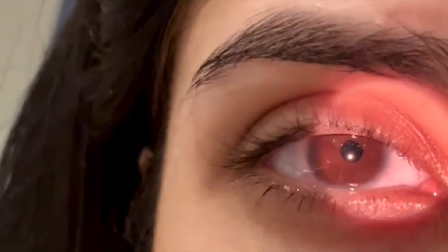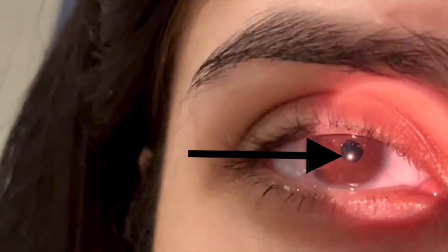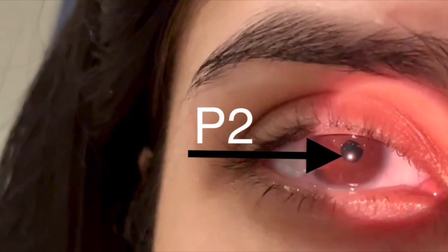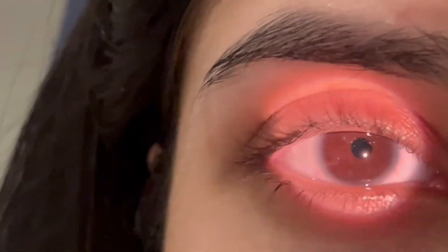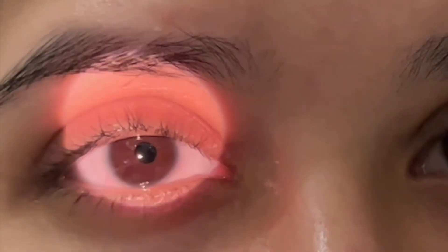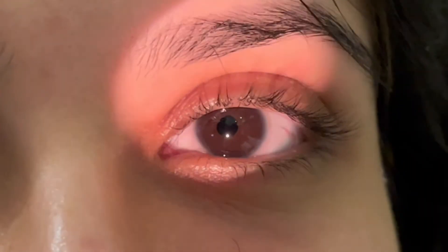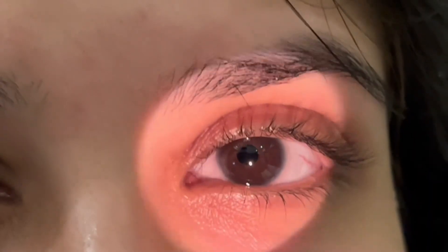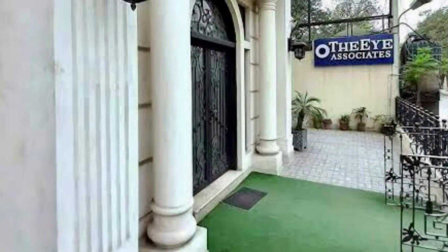In an aphakic patient, because there are no reflecting surfaces from the lens, you only see Purkinje image one from the anterior corneal surface and Purkinje image two from the posterior corneal surface. When you shine the light from one side to another, you do not see any reflection moving in the opposite direction — only a reflection moving in the same direction as the light. When that fourth image moving in the opposite direction is absent, this is an aphakic patient, and you call this a jet black pupil.